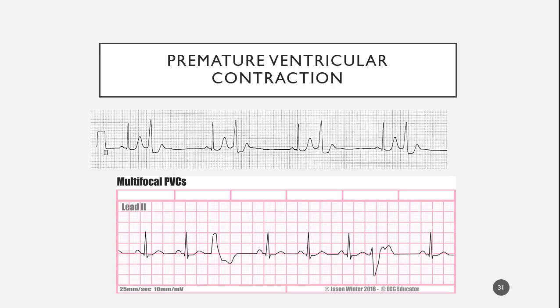What else? Yes? I think it's because the ventricles, okay, the atria and the SA node is already failing to fire in these spots. Also, the ventricles are not coming from the same place. Meaning there's something wrong with the ventricles as well. Okay, all right, so I would agree with you, except let me clarify one little thing here, okay? We don't see this beat here, or this one, or any of the ectopics up here because the atria has failed to fire.